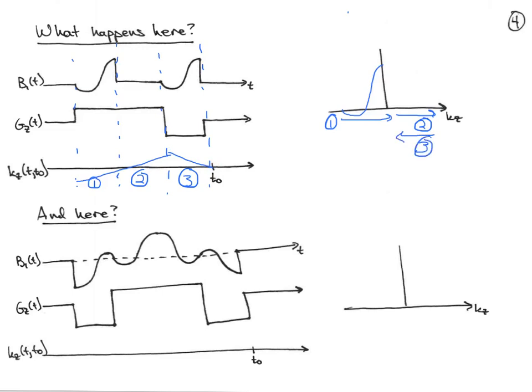And along that path, we lay out the following RF, right? If this is going in time, we'll lay out like that. So this is actually the same pulse as we had before. Right, so if you played out this pulse in the absence of field inhomogeneities and such, you would get the same slice selective excited slice as you got with the previous pulses.